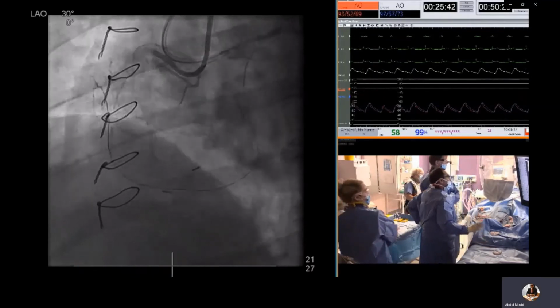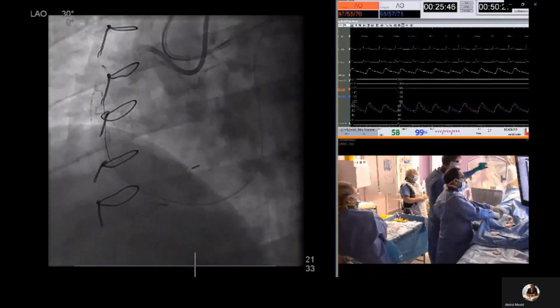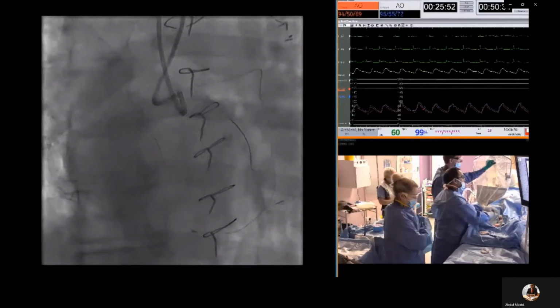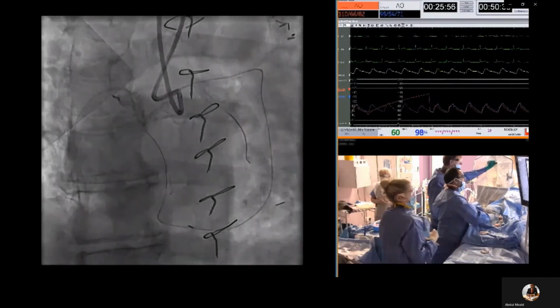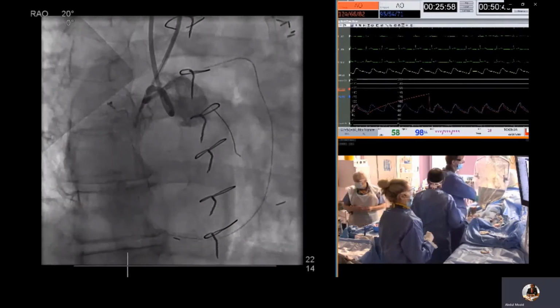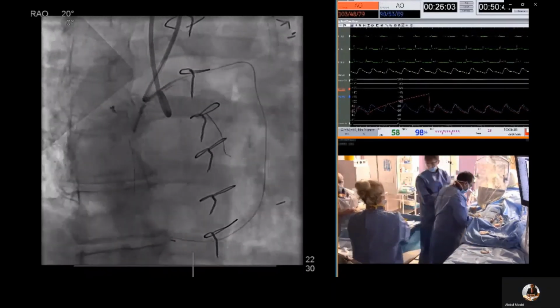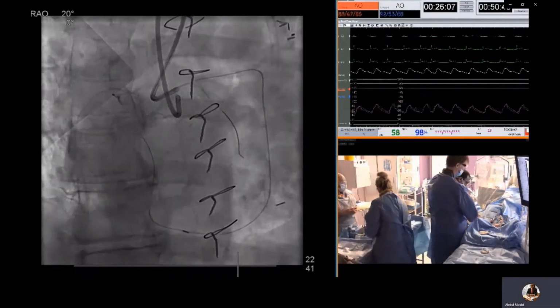It's still unclear whether we have deviated into a branch. In this view, it appears possibly we have gone into a branch. The best way of clarifying this is to knuckle further.